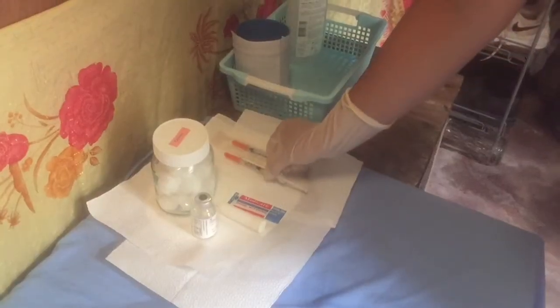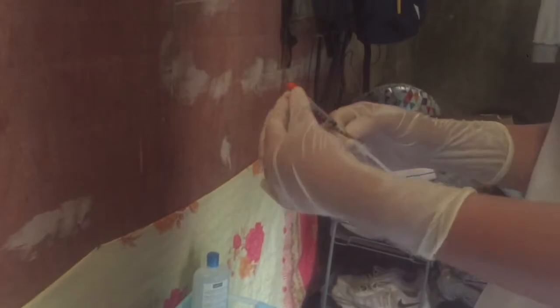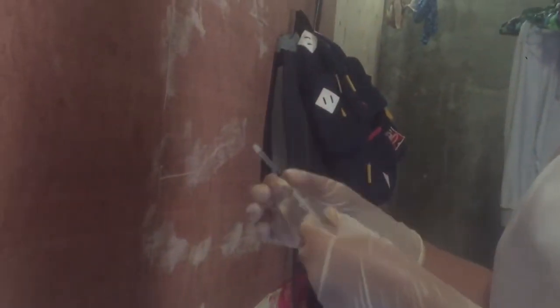So make sure to locate the correct site using landmarks. Always remember that the hepatitis B is given in the outer mid-thigh. There are various vaccines that are administered by intramuscular injection, such as IPV, Penta, and PCV. Make sure to remove the needle cap by pulling it straight off the needle. This prevents the needle from touching the side of the cap and prevents contamination.